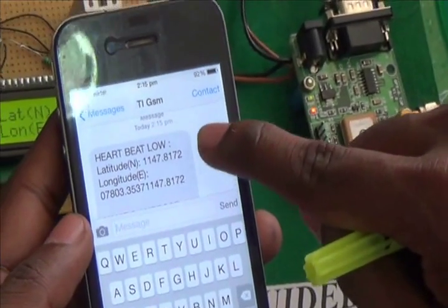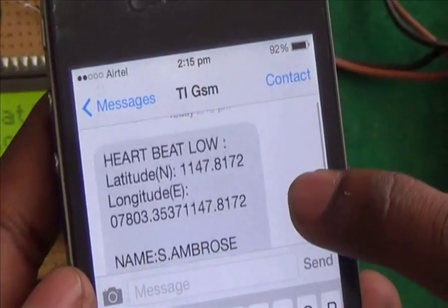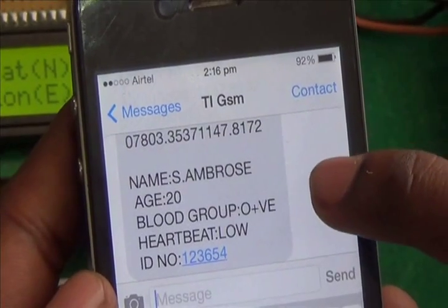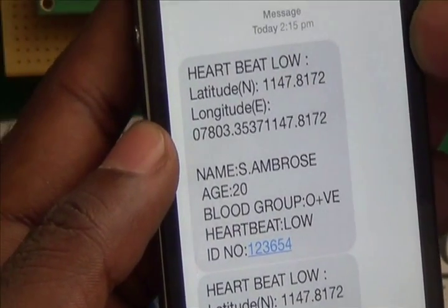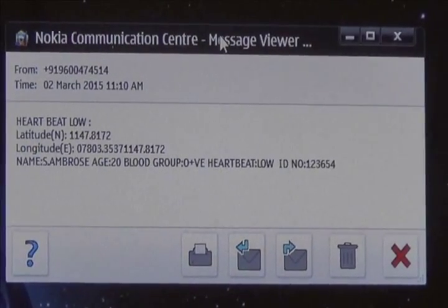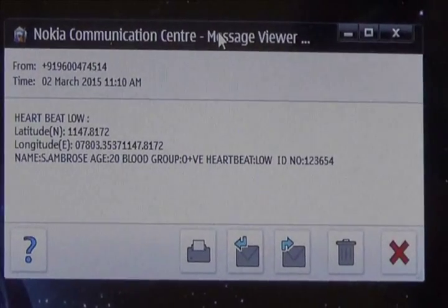There will be a continuous SMS showing the heartbeat condition, the longitude and latitude values, the name of the person, the age, and also an ID number. Then the controller resets. Another intimation is also given to the hospital, and in the hospital control room we are given a number connected to a PC.